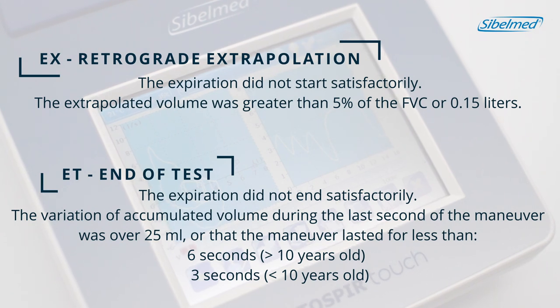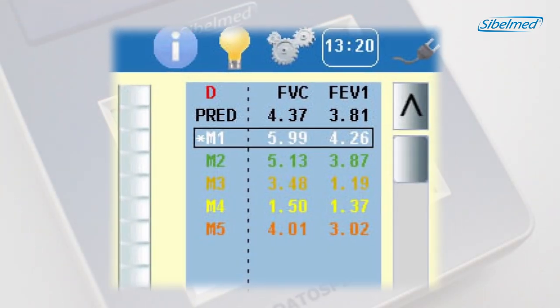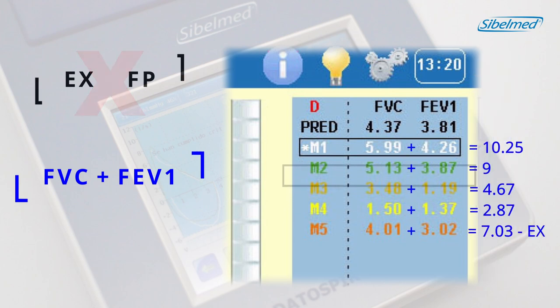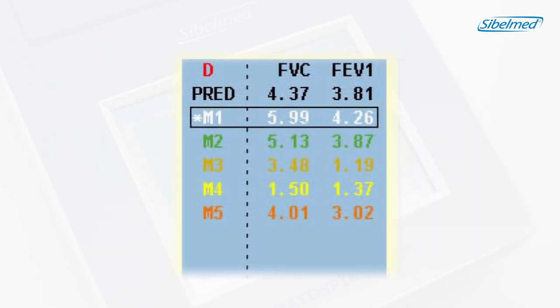Warnings may appear either because the patient has not started abruptly enough or because they did not finish the test correctly. The maneuvers will be positioned according to ATS and ERS criteria. The test with the least warnings is considered the best maneuver, ordered according to the sum of FVC and FEV1 parameters. When the FVC and/or FEV1 labels are flashing, it means that we meet the repeatability criteria — the two best values of FVC and the two best of FEV1 are not much different. The maneuvers are ordered from best (M1) to worst (M8), in different colors: green for acceptable and repetitive maneuvers, and from yellow to red for lower quality ones.